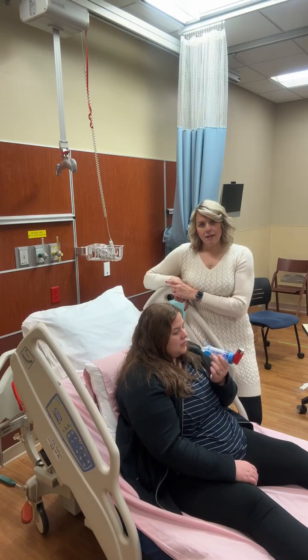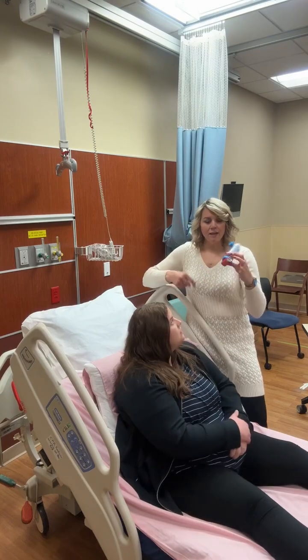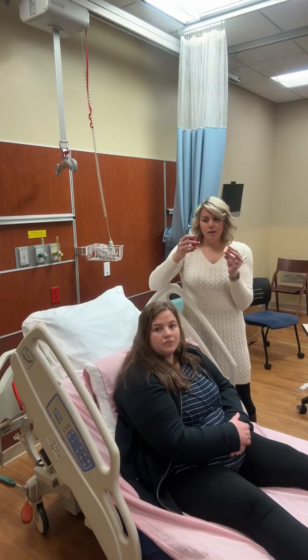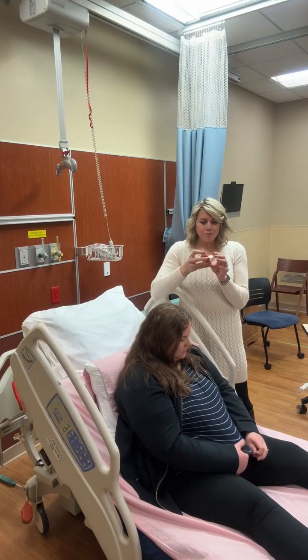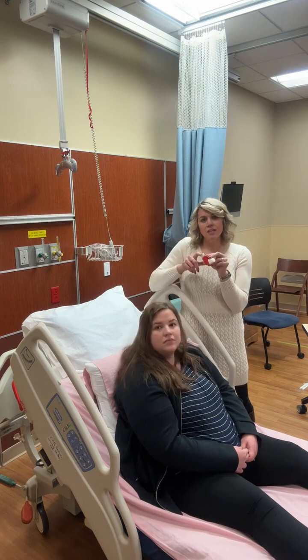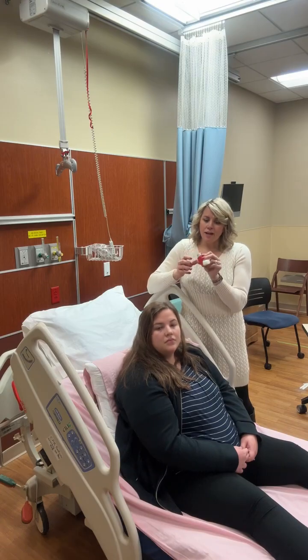Perfect. Now, just make sure that when the patient gets done doing that, they recap their inhaler so that nothing gets inside of it. And cold air actually depletes the canisters, so don't leave this in your car in the wintertime, because then you'll come to an empty inhaler.